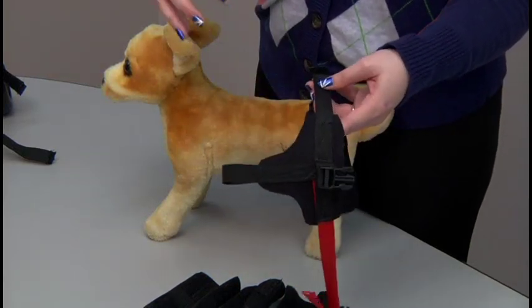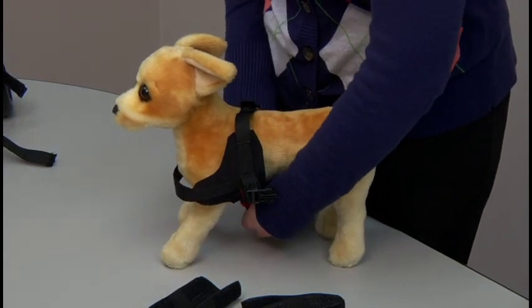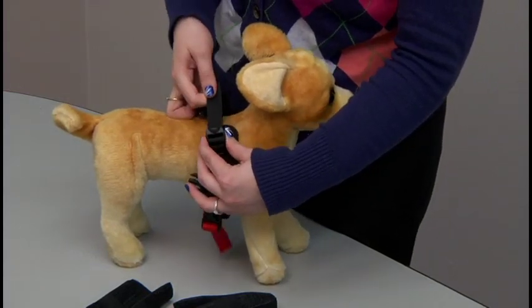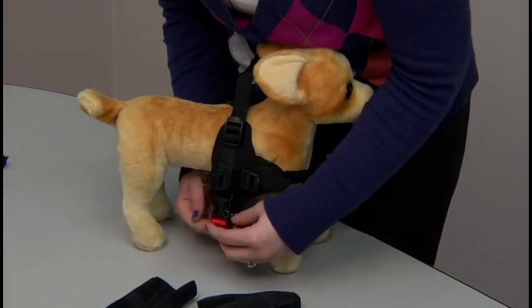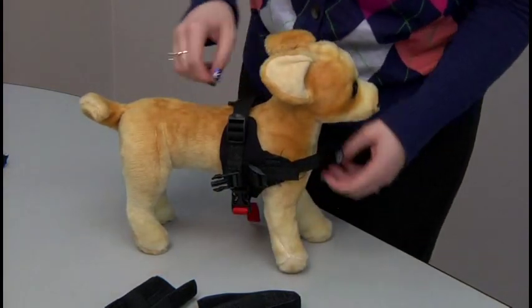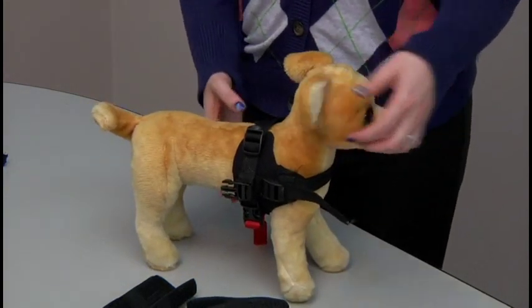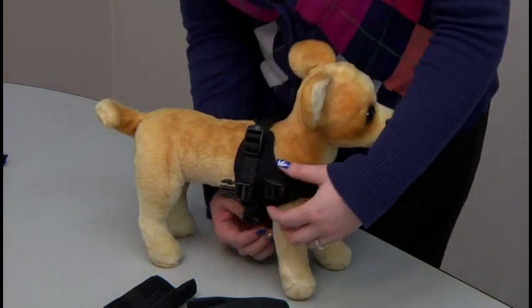Take the harness with the dog's head going through here. The red strap goes underneath the belly, behind the front legs. Clip it back in and then tighten up the straps. Make sure that the neoprene shields are going over the dog's shoulders. All the straps should be snug, and the shields should be over the shoulders. After you have the straps snug, take it off the dog in order to put the comfort sleeves back on.